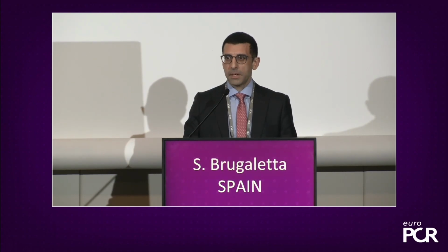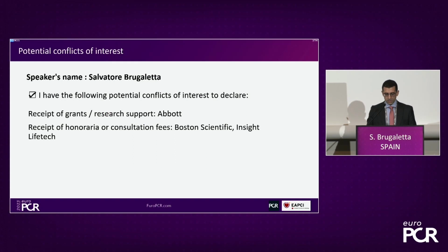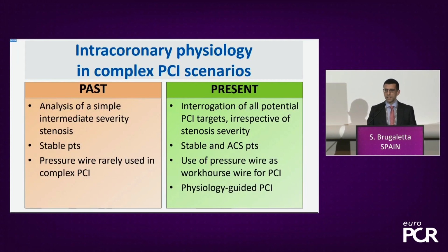Thank you, Emanuele. As you said, we have to change a little bit the paradigm about how to use physiology in our daily clinical practice. So these are my disclosures. We have to think that something can change from the past to now. Thinking about, for example, the 80s, we were using physiology for analyzing intermediate lesions, but now we are doing a lot of physiology, especially in three-vessel disease. We're using it not only in stable, but also in stabilized ACS patients. And many times we also use the pressure wire as a workhorse wire for PCI. That is not always the best solution.